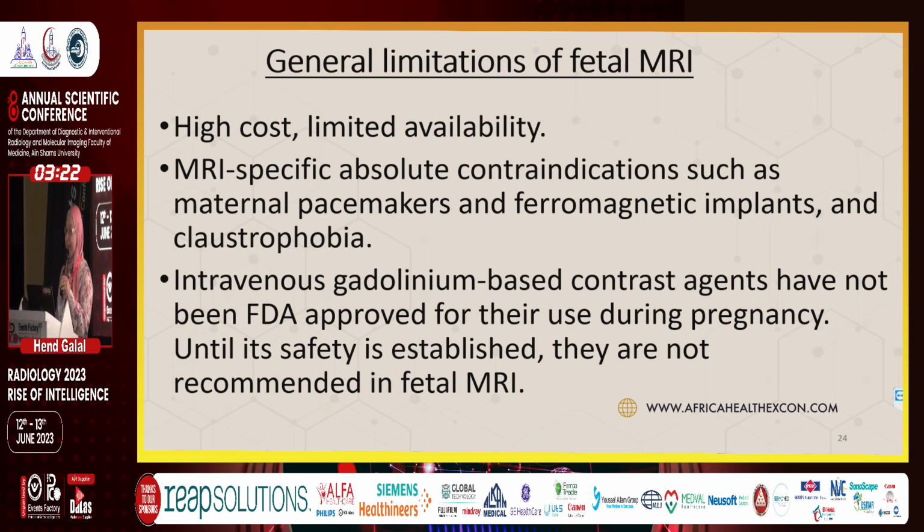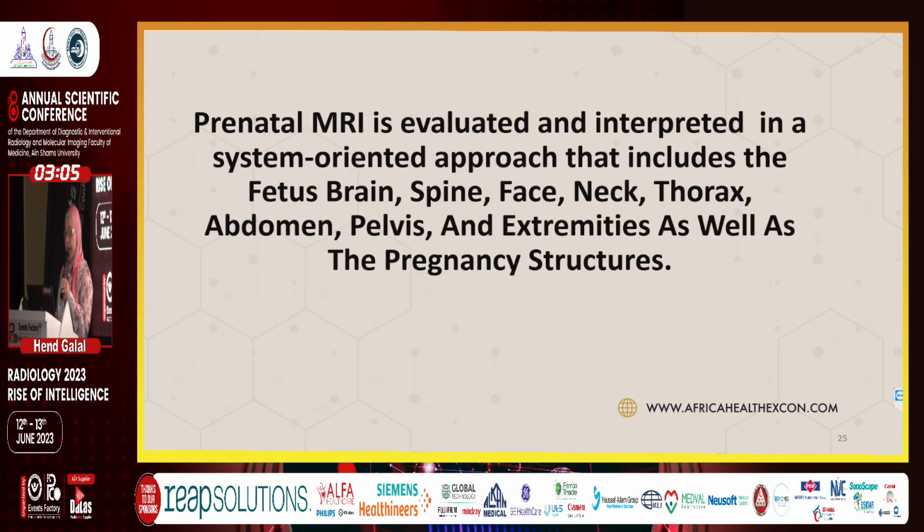About the general limitations of fetal MRI: high cost and limited availability. Gadolinium-based contrast has not been approved by the FDA as safe in pregnancy, and we don't use it until now.